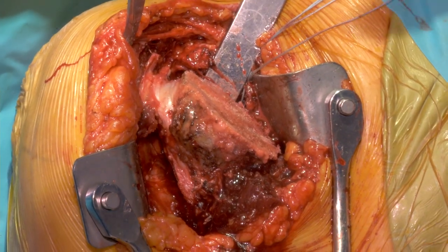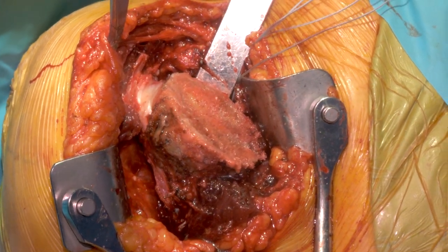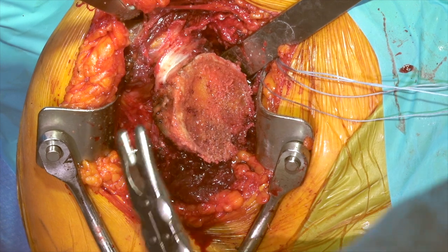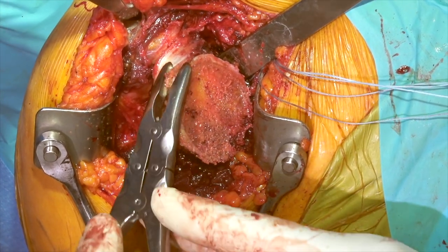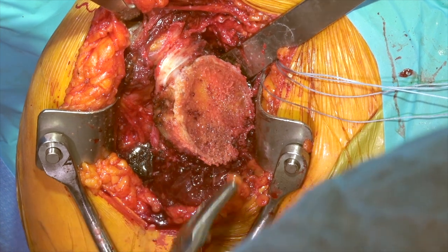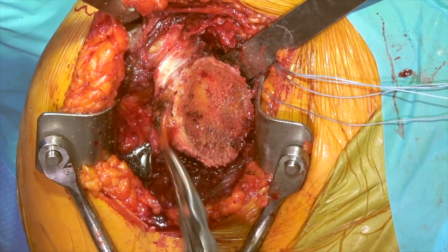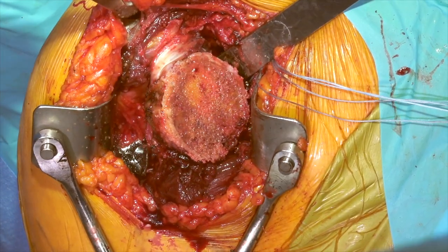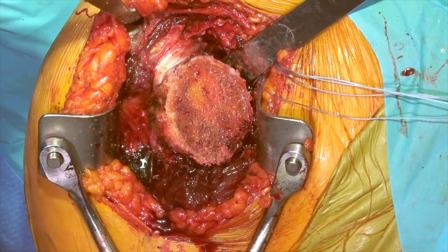We can check and make sure that we have some bone remaining posteriorly, and that all looks very good. Now is a good time to look at the actual humerus — you'll see a white thickened line of the cortex. We want to make sure there's no bone beyond that white thick line, because that would be considered primarily osteophyte. This gives us a true understanding of the actual humeral head. Looking at this, we'll estimate it's about a 44, so we'll take a 44 humeral head.